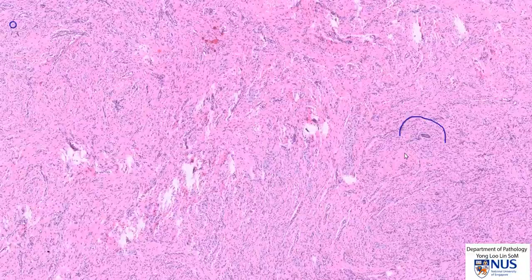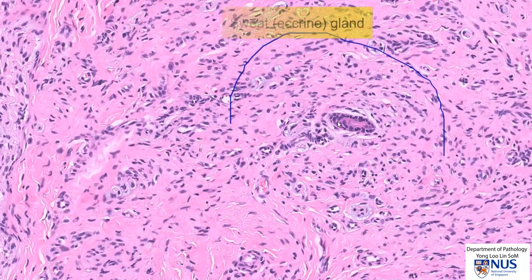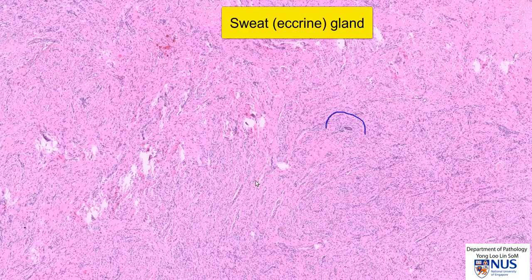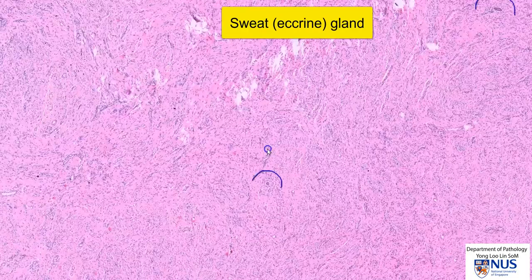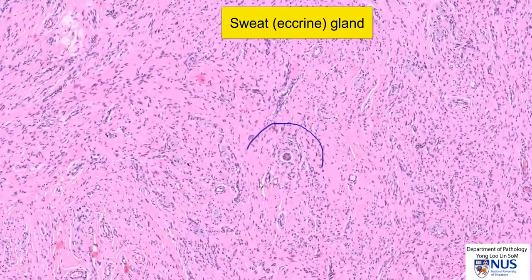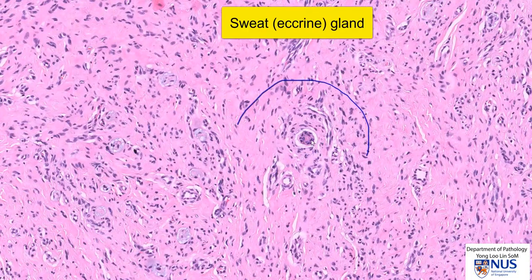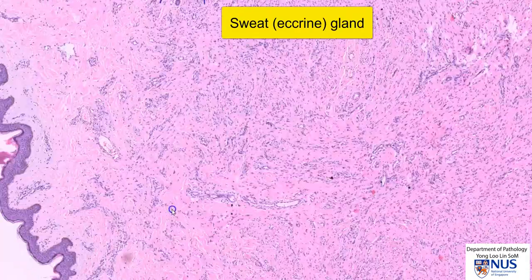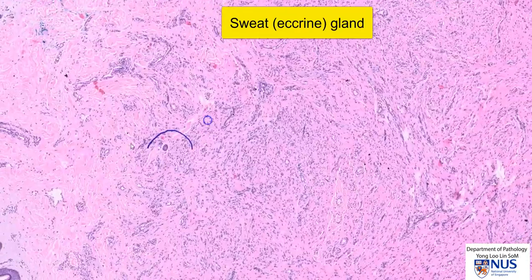In neurofibromas, we may sometimes see entrapped normal adnexal structures. For example, here this is part of an eccrine sweat gland. And if we move around, we can see a couple of others — there's one here and also another one here.